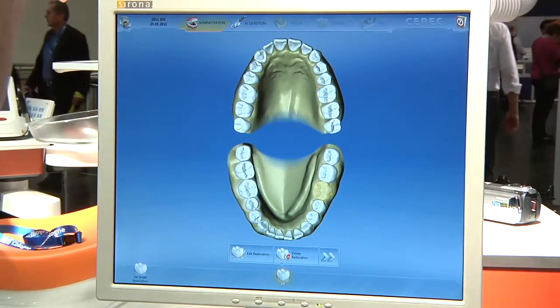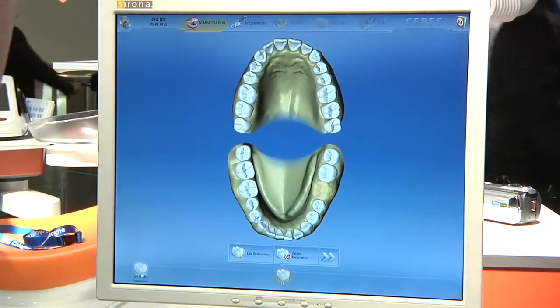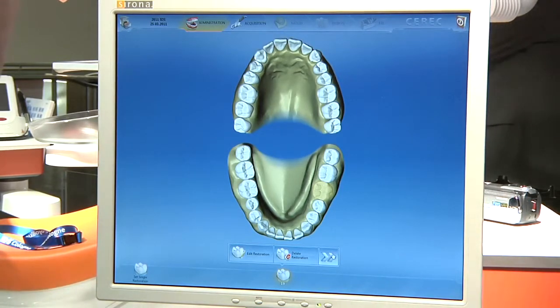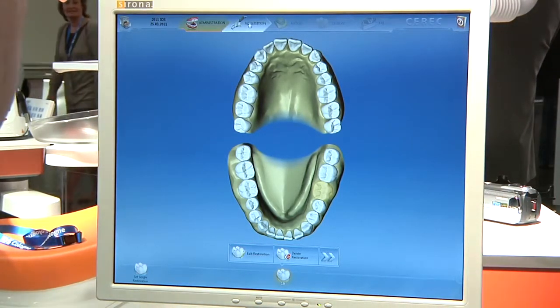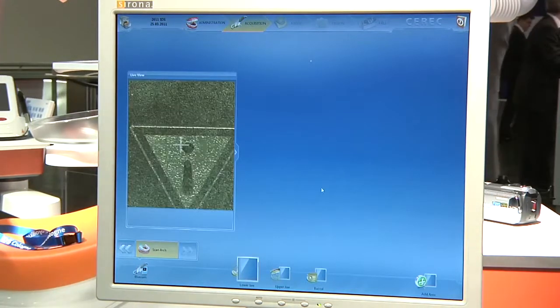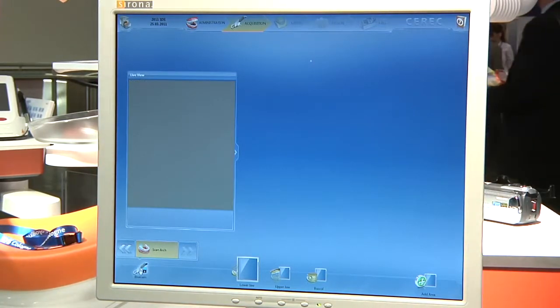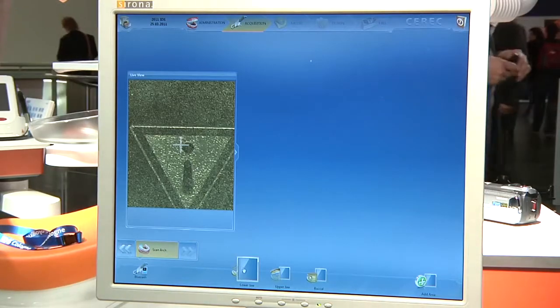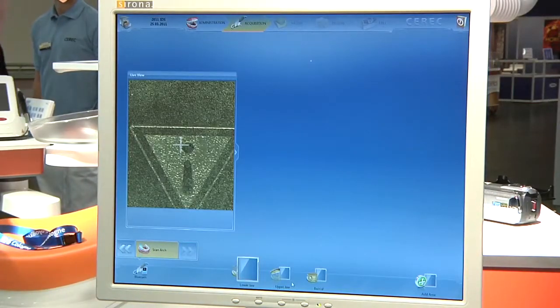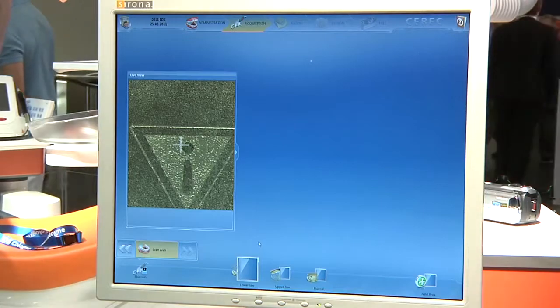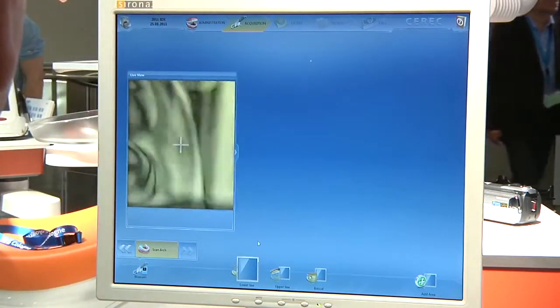Everything is good. Since we're set at the single restoration, we'll just arrow ahead into our acquisition. Now the camera's live — you can turn it on and off by going to the blue cam. We're going to scan an arch. One of the big differences you'll notice now is it's not prep and antagonist or whatever — it's strictly lower jaw, upper jaw, buccal. The window here is highlighted for our lower jaw, so we're going to start there by taking our pictures.